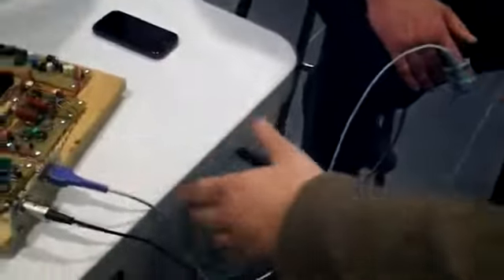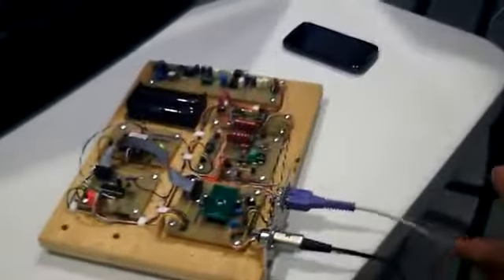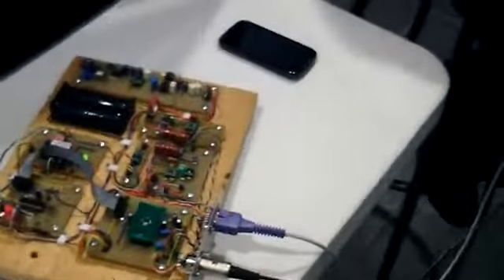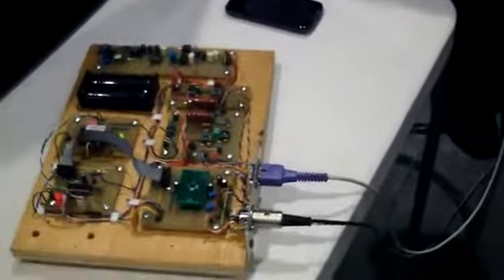One of the things that we're working towards is that this is an industry standard sensor. We didn't try to make anything out of the box or abnormal, so that this can be deployed economically with current stuff that medical professionals use every day. The innovation you made was this platform. Yeah, it's integrating all these different devices, making it extremely mobile and extremely economical. The cost is way lower than we had before.